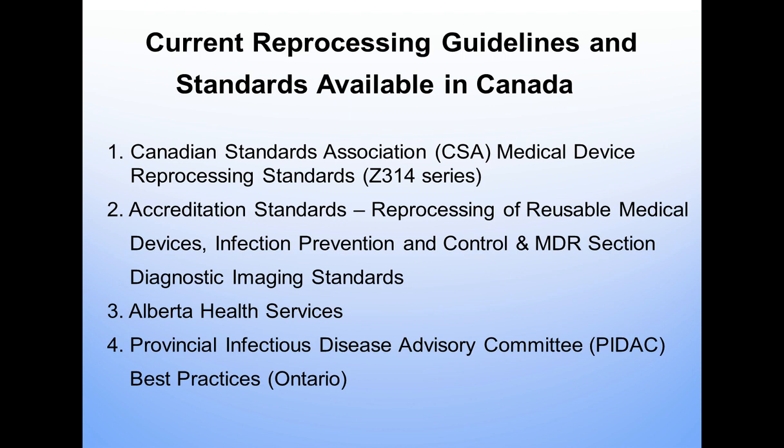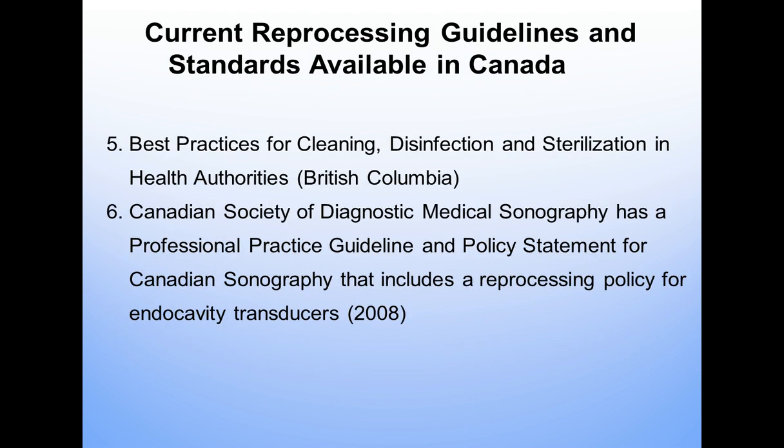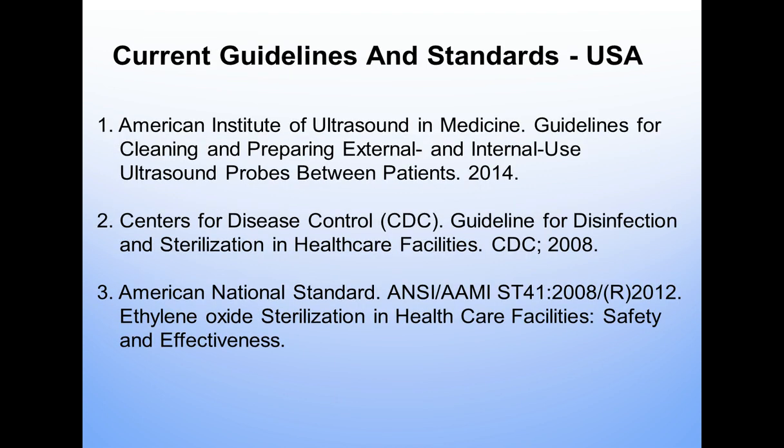It's the PIDAC document, Provincial Infectious Diseases Advisory Committee Best Practices. Likewise, British Columbia has a similar document, and the sonographers have a similar document, the Canadian Society of Diagnostic Medical Sonographers. So there are a lot of standards in Canada available to us to ensure that we are meeting, providing safe patient care to our clients.